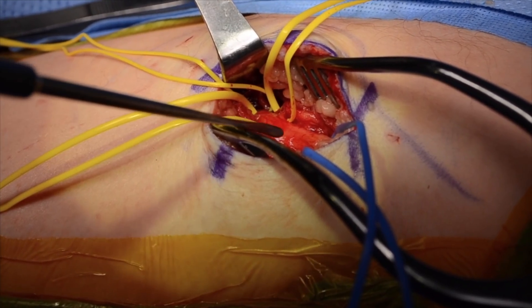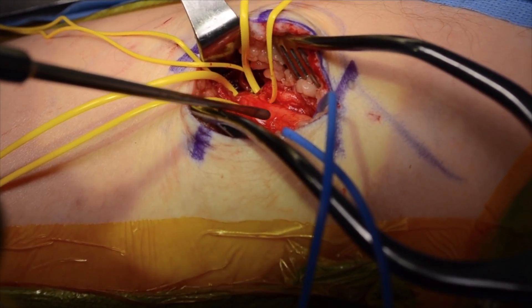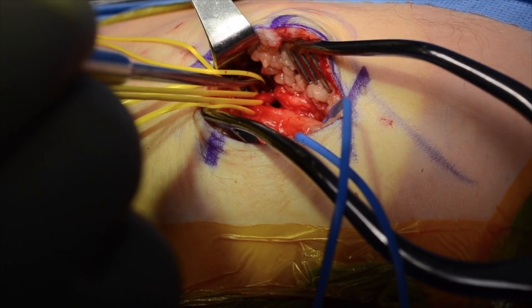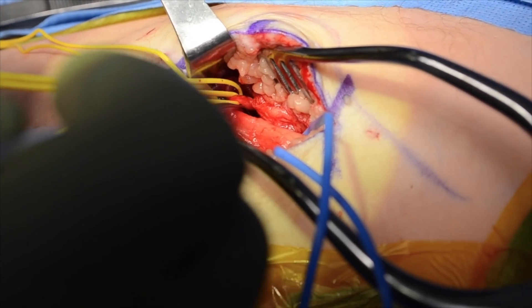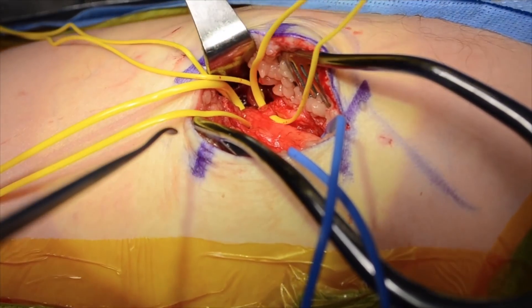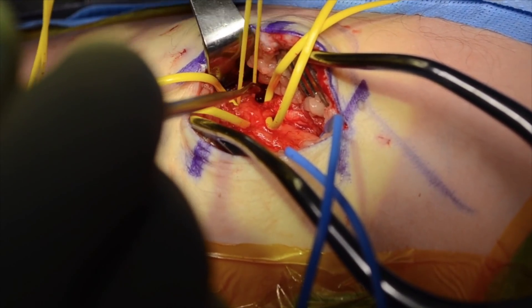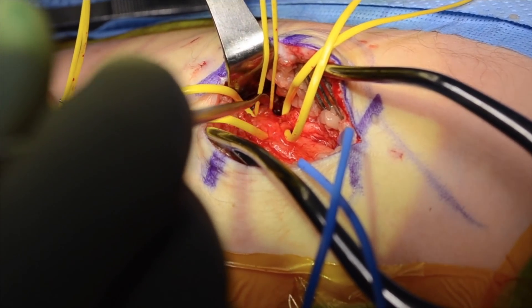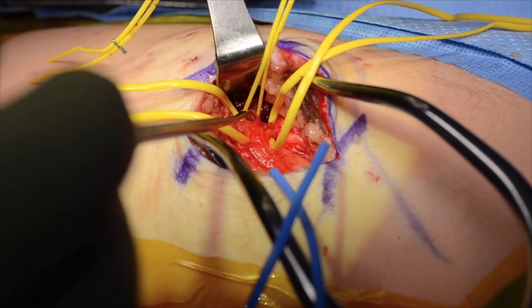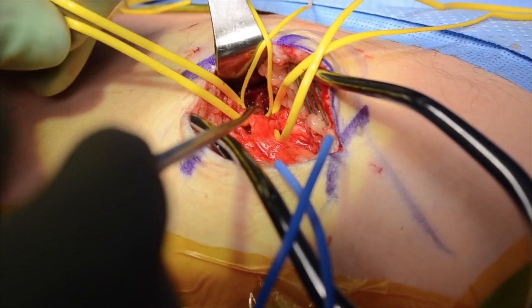Here we demonstrate the common peroneal nerve or peroneal nerve proper, the articular or recurrent genicular branch as it courses to innervate the superior tibio-fibular joint, the deep peroneal nerve, and finally the superficial peroneal nerve.